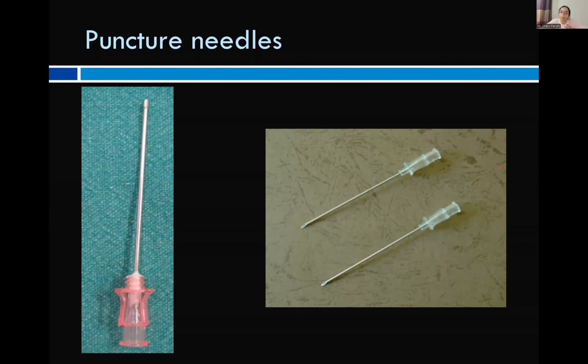In a double walled puncture, the needle is taken through and through the artery, and then the inner stylet is removed and the needle is pulled back. So once this needle now enters the lumen of the vessel, we'll see a gush of blood from the other end. So that's when we know that we are in the arterial lumen.